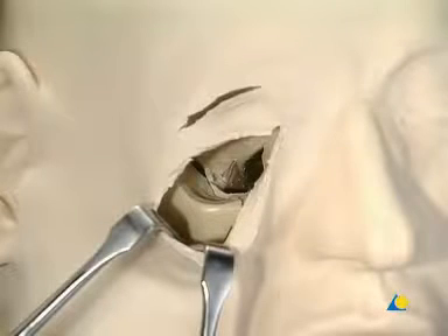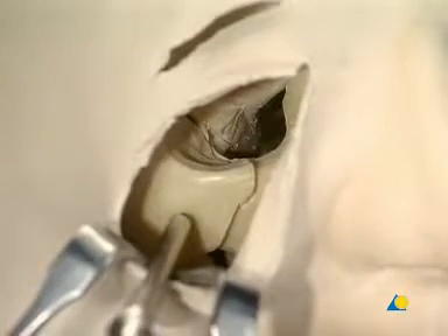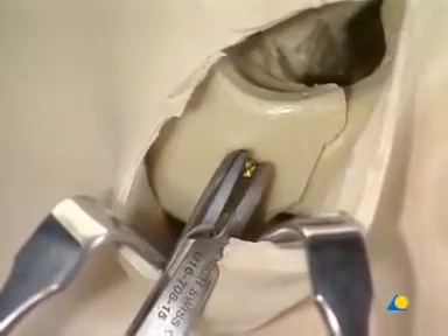In this model, the reduction of the zygomatic maxillary complex fracture is begun by inserting a manipulating screw in the zygoma. The 1.1 mm drill bit with 6 mm stop is used in a position that allows optimal bone manipulation but does not interfere with later plating. A 1.5 mm cortex screw is inserted using the 1.5 screwdriver with holding sleeve but is not fully inserted down to the bone. The screw is held with the forceps and the bone fragment is manipulated until it's reduced.